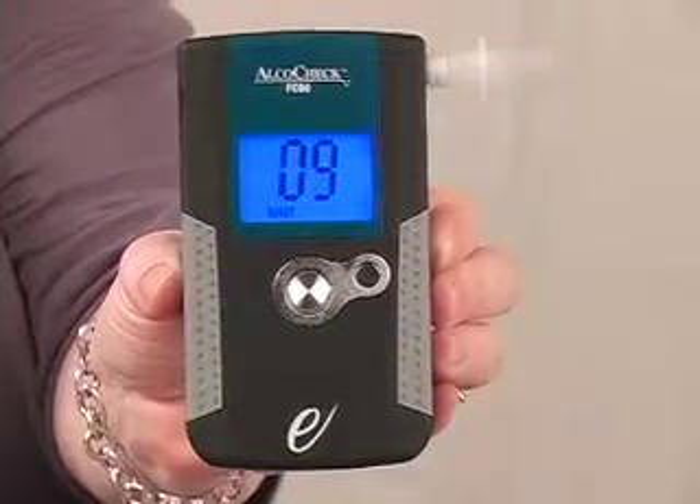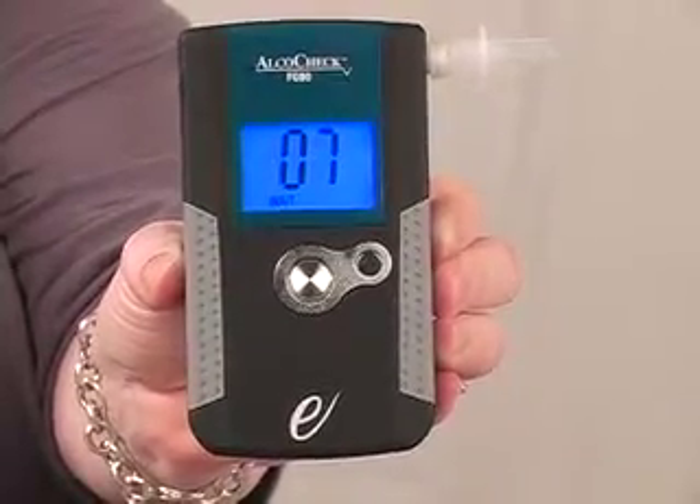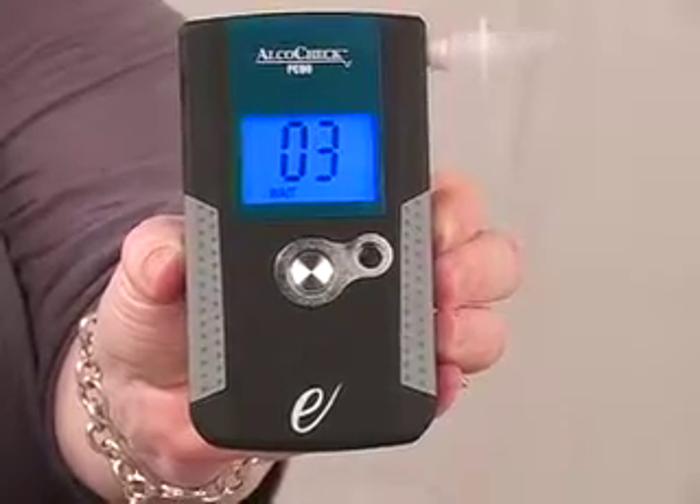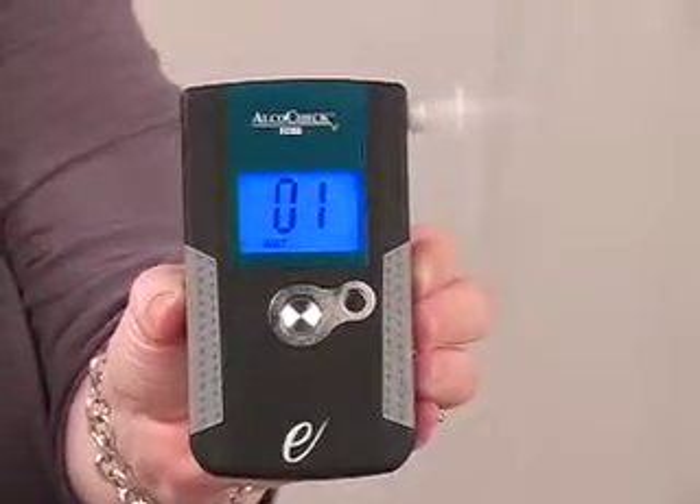The device will count down from 15. The donor should have nothing to eat or drink for 15 minutes prior to testing. Hand the device to the donor.